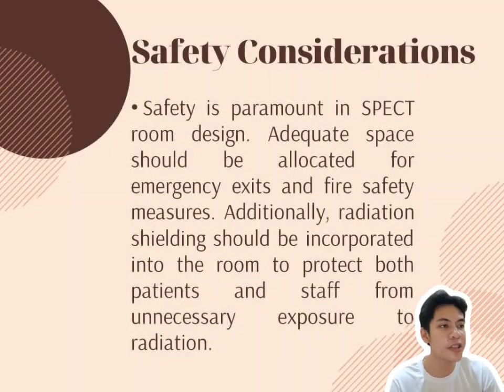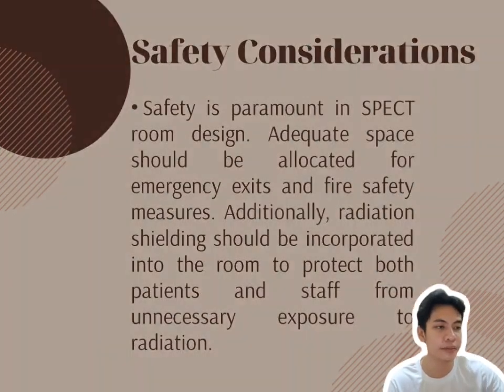Safety consideration. Safety is paramount in SPECT room design. Adequate space should be allocated for emergency exits and fire safety measures. Additionally, radiation shielding should be incorporated into the room to protect both patients and staff from unnecessary exposure to radiation.